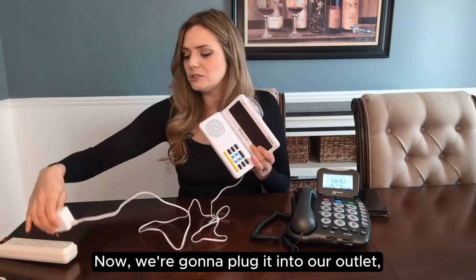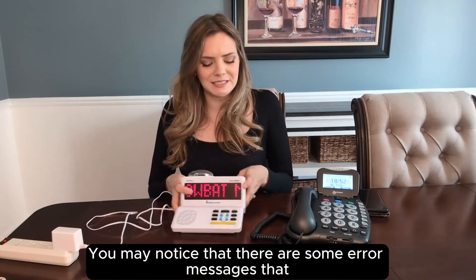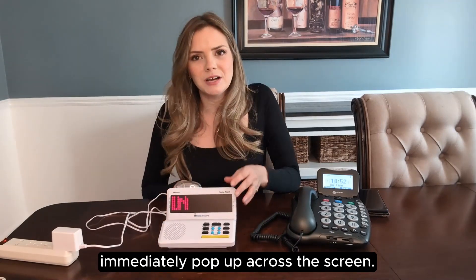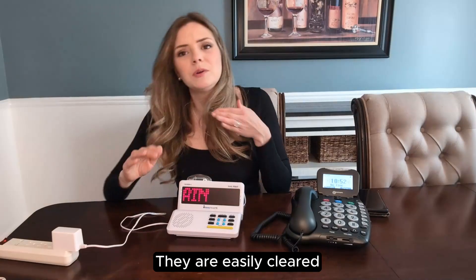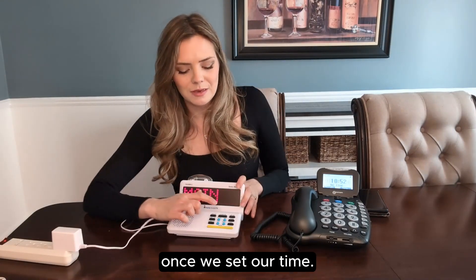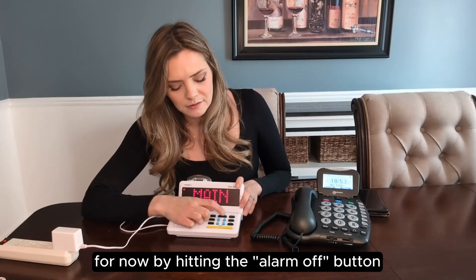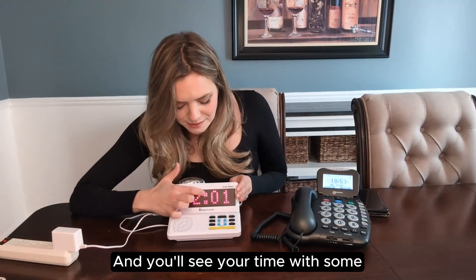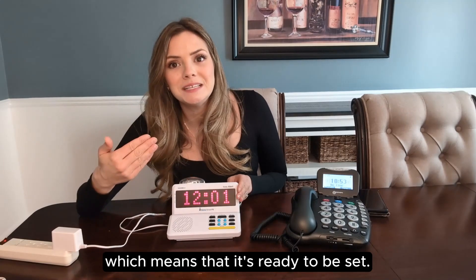Now we're going to plug it into our outlet and we're ready to go. You may notice that there are some error messages that immediately pop up across the screen — there's no reason to be alarmed. They are easily cleared and we will get rid of them for good in just a moment once we set our time. We're going to clear those messages for now by hitting the alarm off button right here on the top. You'll see your time with some flashing dots in the middle, which means it's ready to be set.